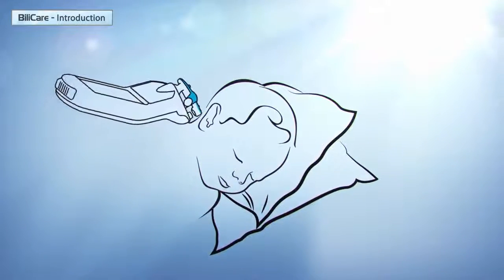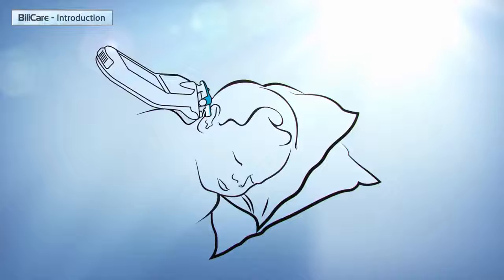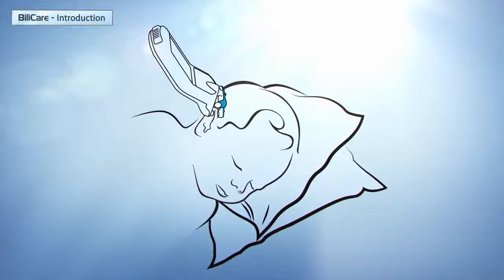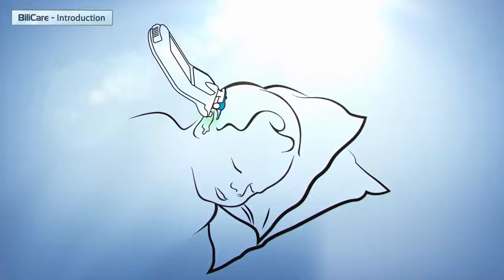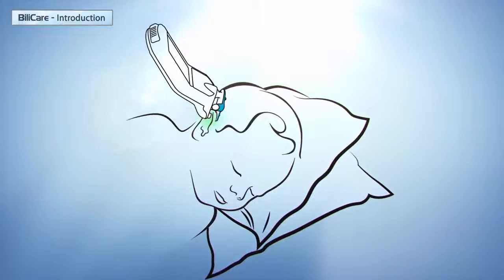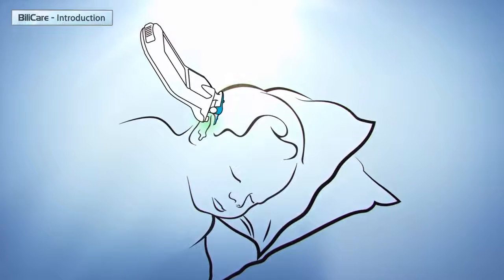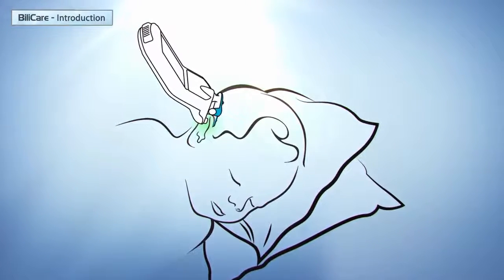Bilicare applies a certain pressure at the point of measurement. Blood in the measurement area may affect the result. Therefore, the blood is literally pushed away from the light path by applying pressure that is a bit higher than the systolic pressure. On the other hand, the pressure is restricted in order not to disturb the baby.